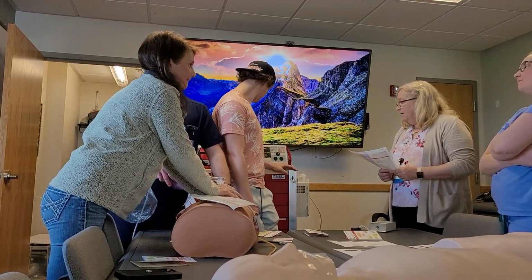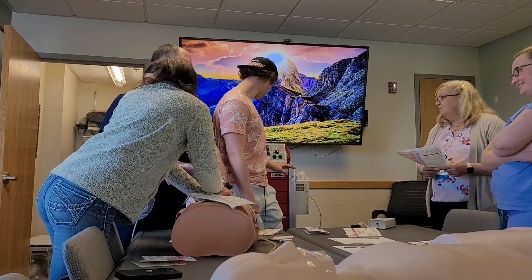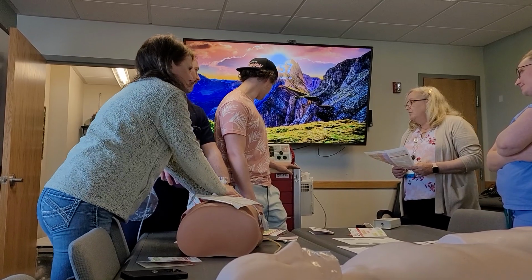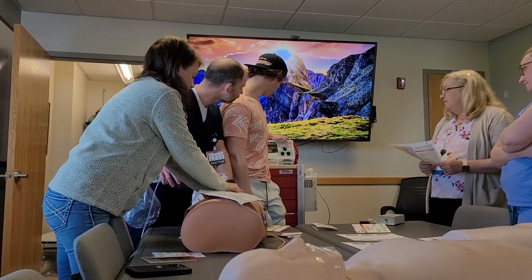Okay. We are still in VTAC. What's our next step? What are we gonna do next? Next check, we're gonna shock him right away as soon as we can again. Okay. So I'm gonna charge him again for another 200. Charging.